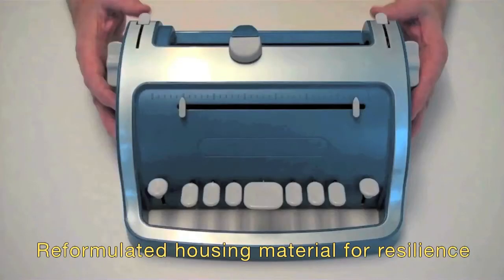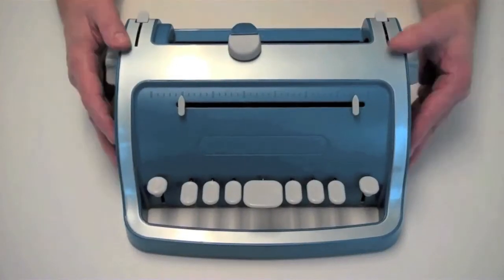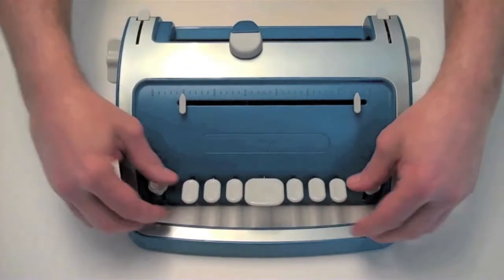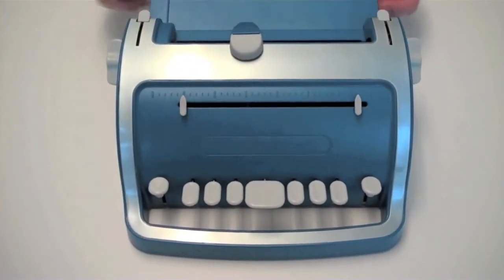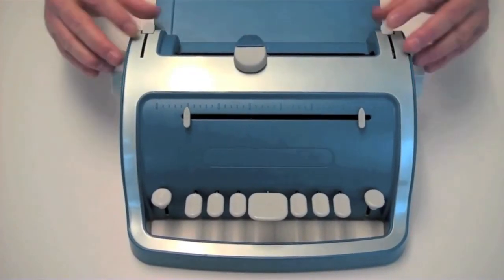All the plastics on the Brailler have been reformulated to make them more resilient. The auto casing, keys, backrest, carriage button, and all the knobs.